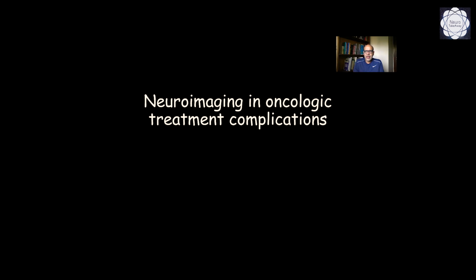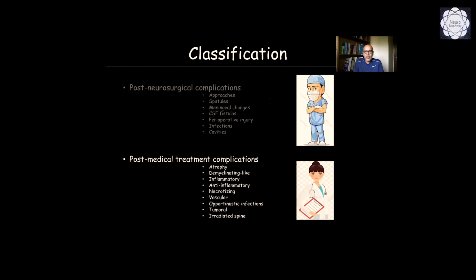Today, we are going to see the second part of neuroimaging in oncologic treatment complications. I remind you that last week we looked over the post-neurosurgical complications, and today we will review some of the problems that can happen after the treatment with chemo and radiotherapy.